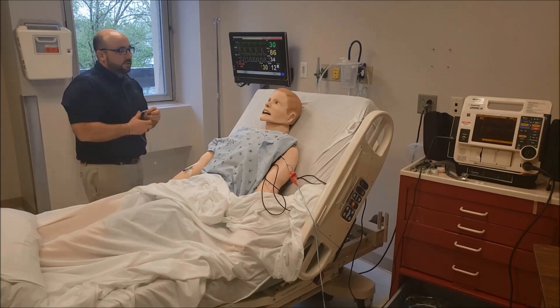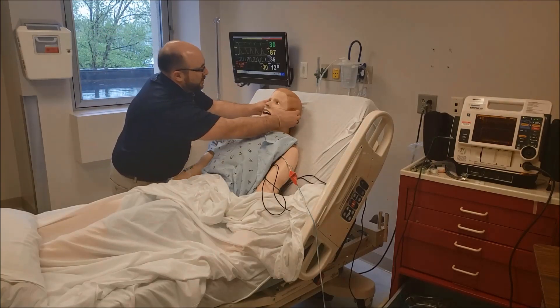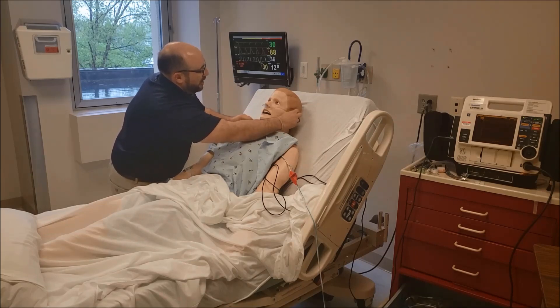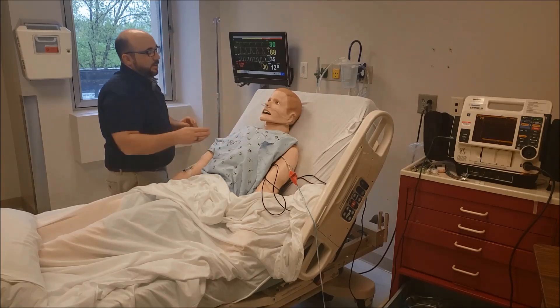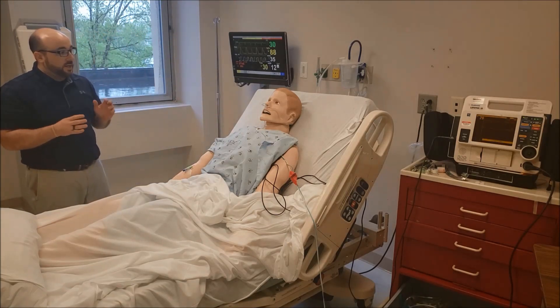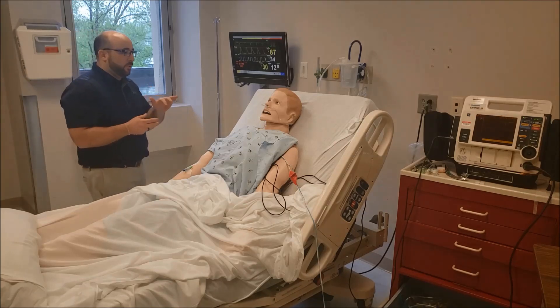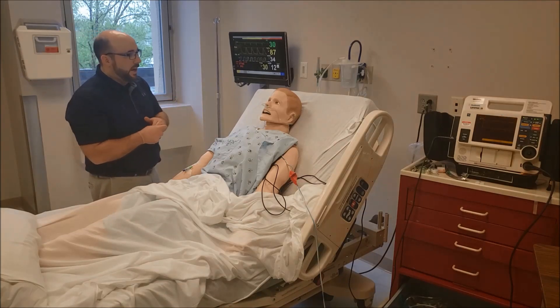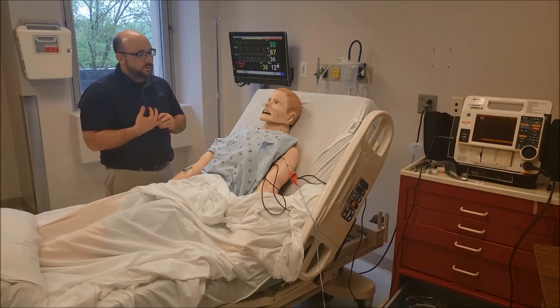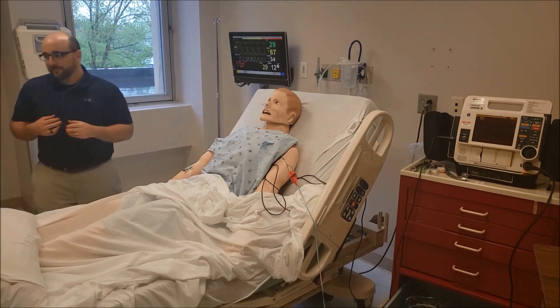So I'm going to do exactly what I would usually do — apply oxygen. We'll apply three or four liters of oxygen. We're going to put an IV in — he already has an IV — and we're going to put the monitor on the patient. He is unstable. I could consider atropine 0.5 milligrams IV, but he is so unstable I'm going to go directly to transcutaneous pacing.